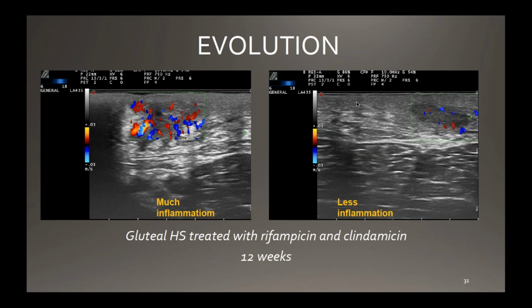Well, the patient will tell us that he or she is better, but we can make it also quite evident for the dermatologist and for the patient, because our patients are taught to see their own ultrasounds so that they can see if the treatment is working for them. This personalization, as I've told you, is very important in the relationship of the dermatologist with the dermatology patient and even with you.